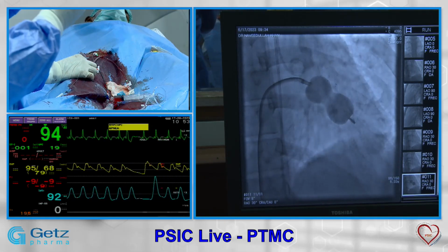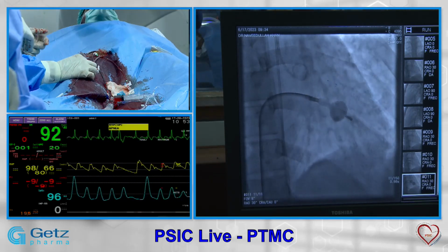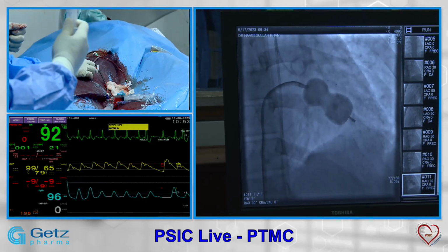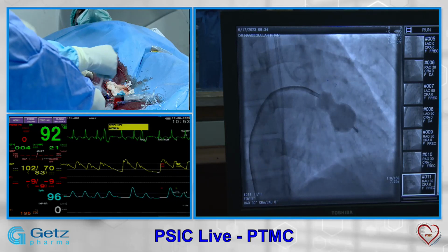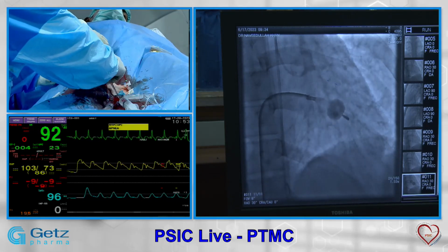The technique of not losing your balloon is that once your balloon is fully inflated, the first operator should push it forward so that once you deflate it, the balloon does not come back into the LA. So you will not have to cross it again and again.